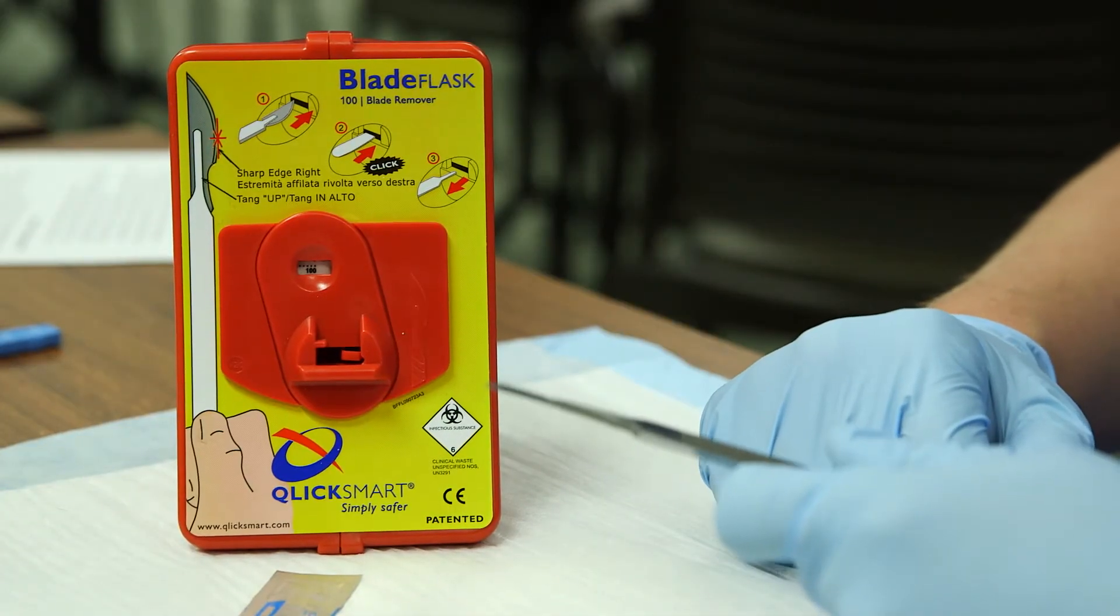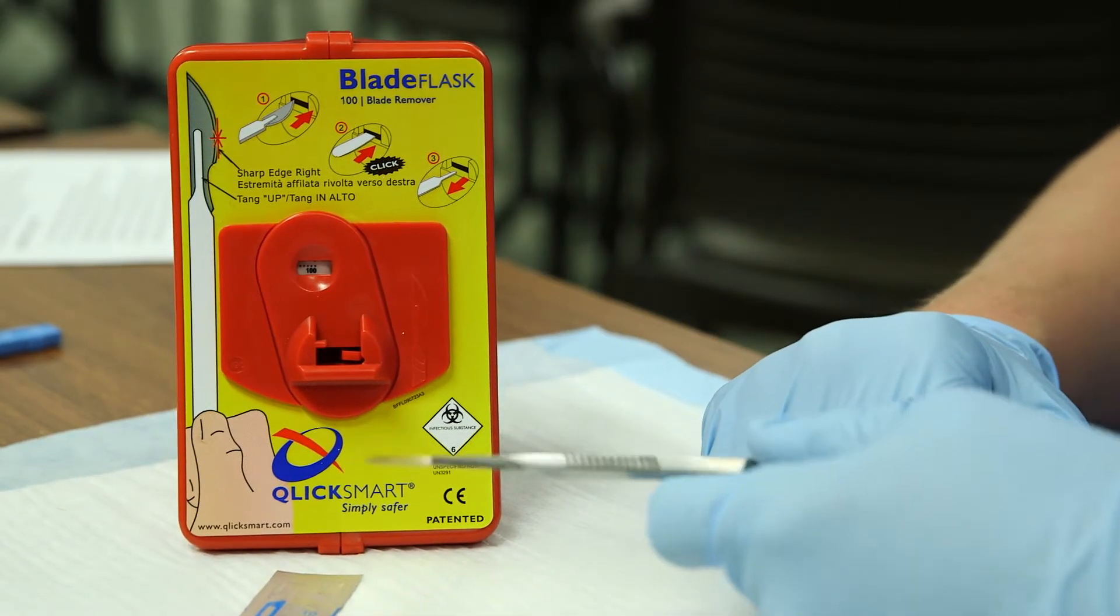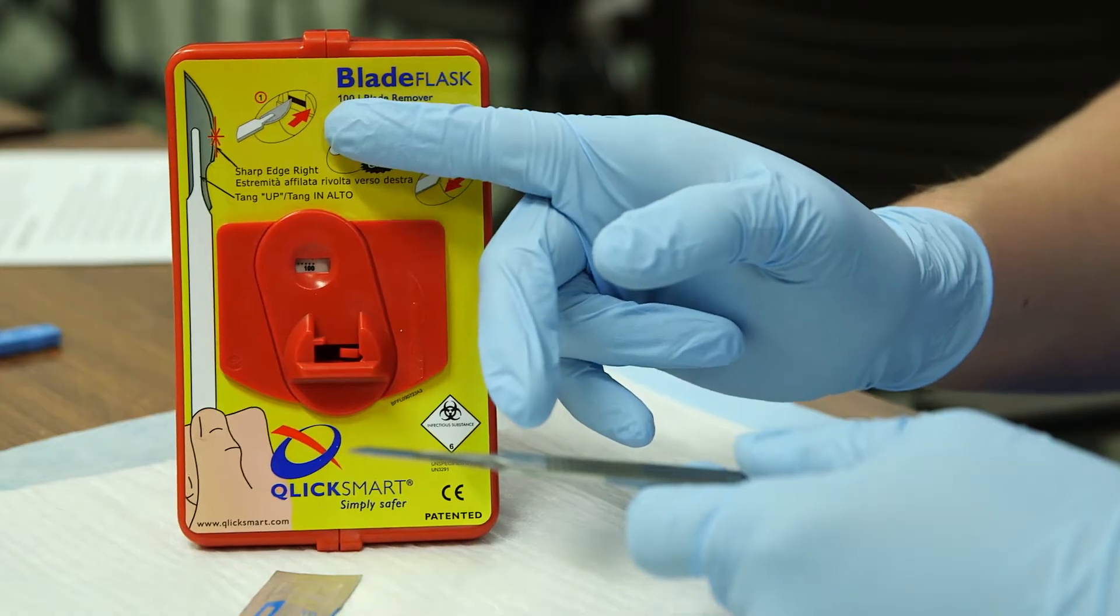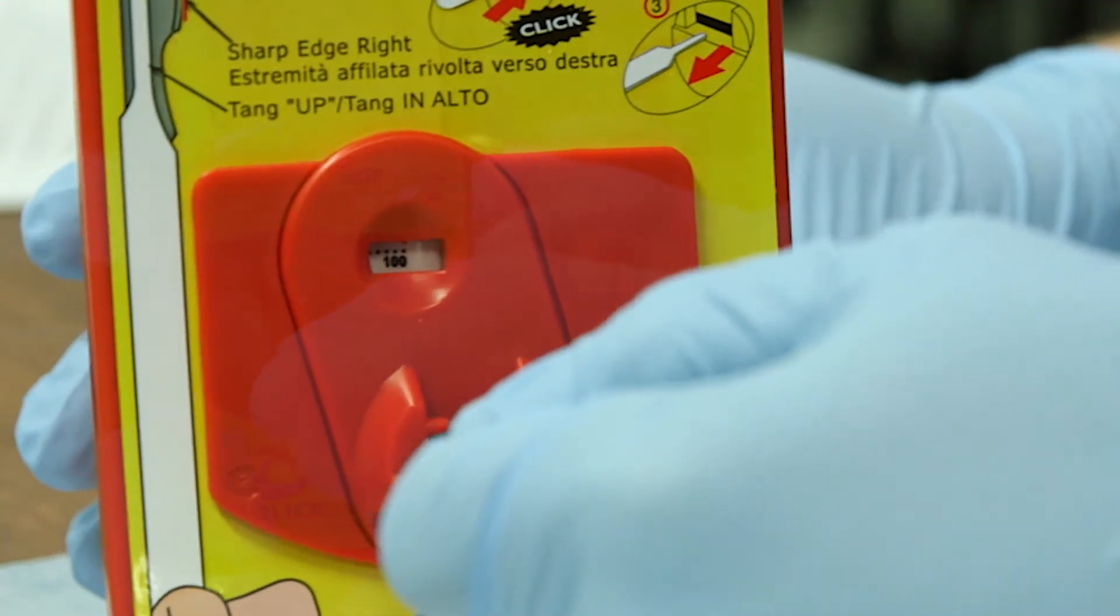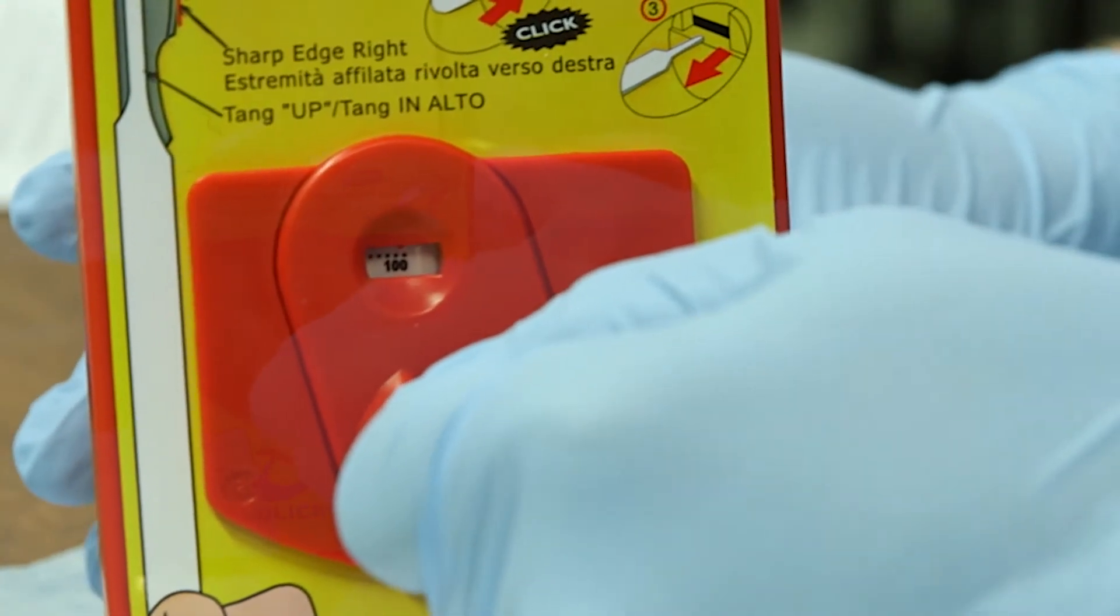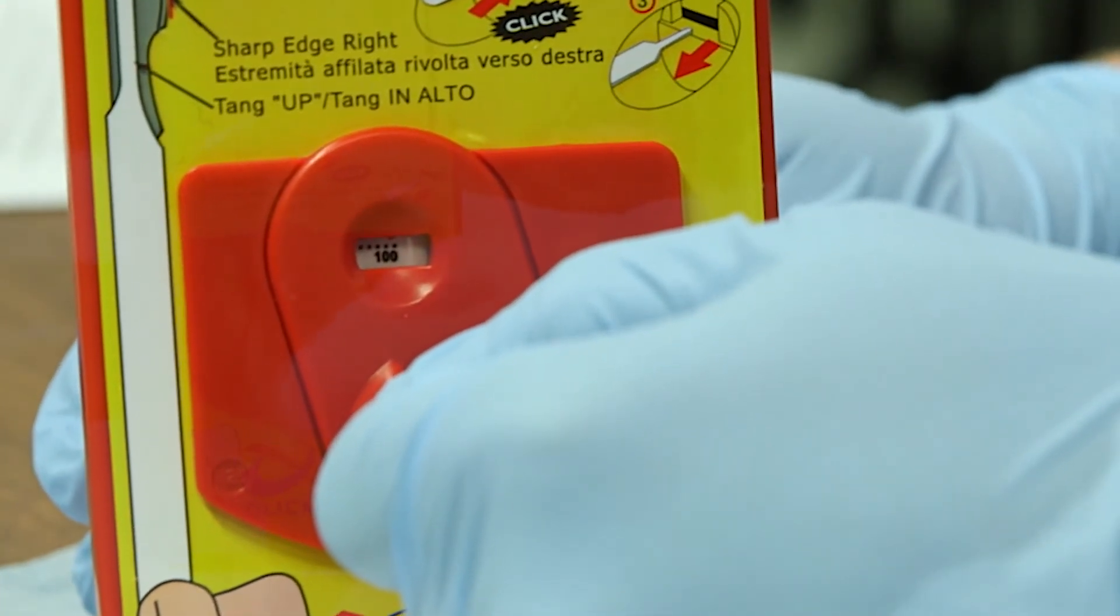To remove a blade from your scalpel, orient the blade as shown on the front of the blade flask. Push it in all the way and you will hear a click. Then pull back and you will hear the blade drop closed.